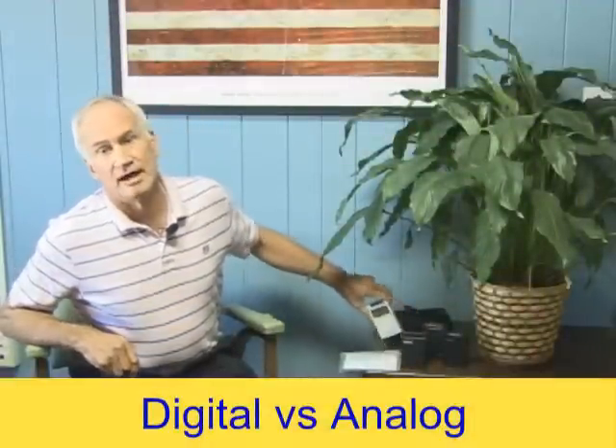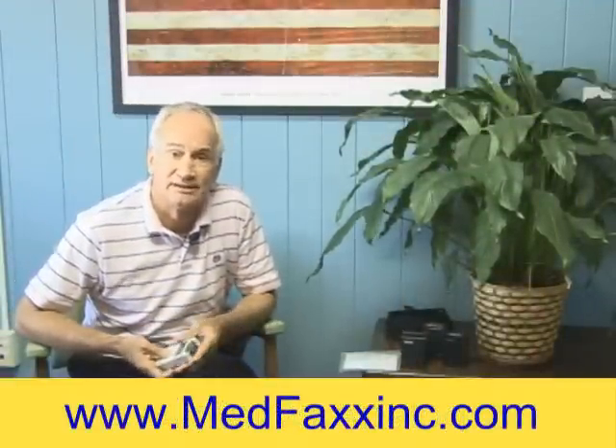Hi, today I wanted to show you how you use your TENS unit. This type of TENS unit is what we call an analog TENS unit.